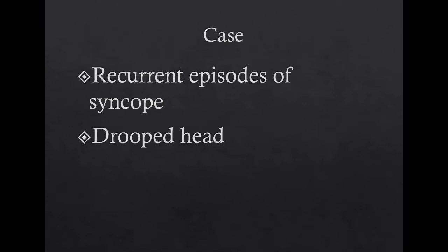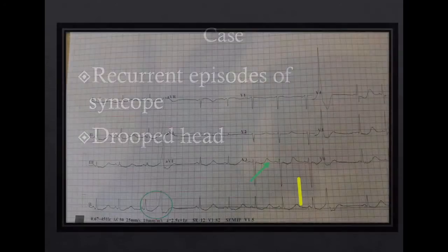He runs out with the haloperidol and jabs this lady with haloperidol. Do you guys think, having a look at that ECG rhythm strip, haloperidol was a good idea? No. What do you guys notice?